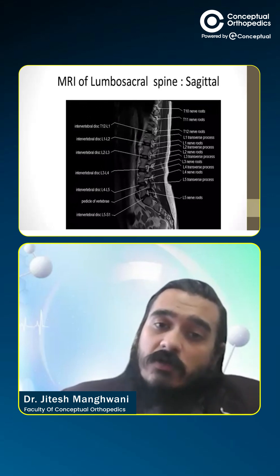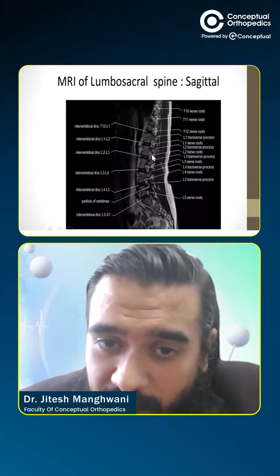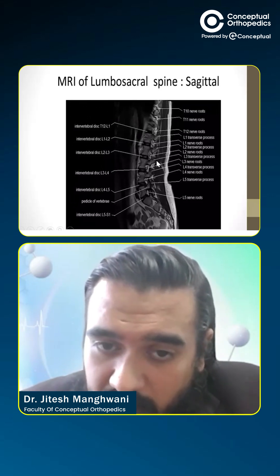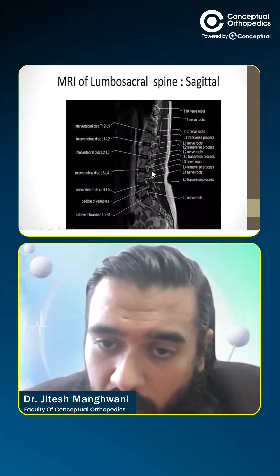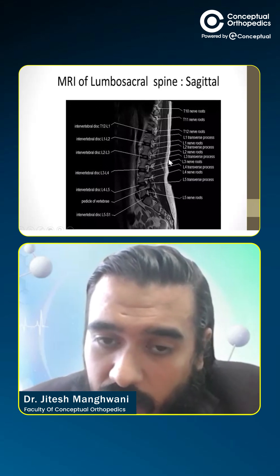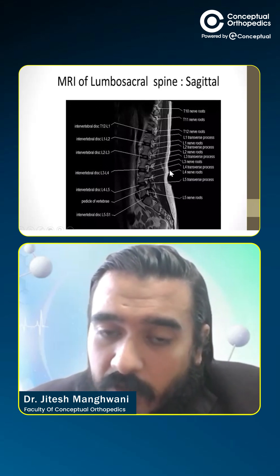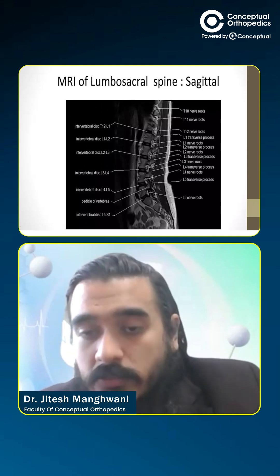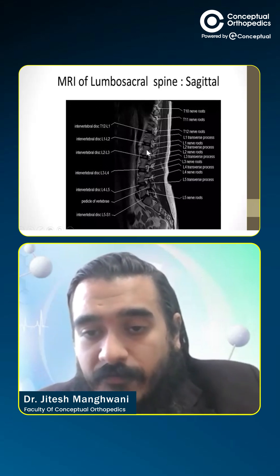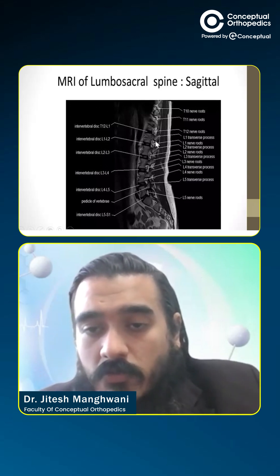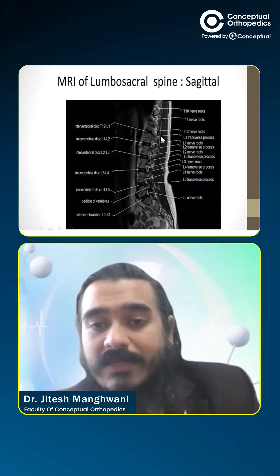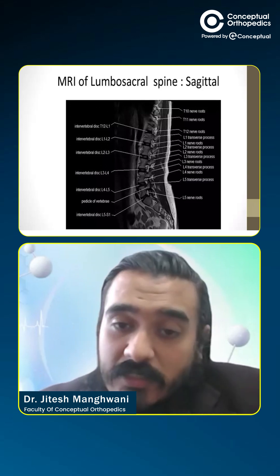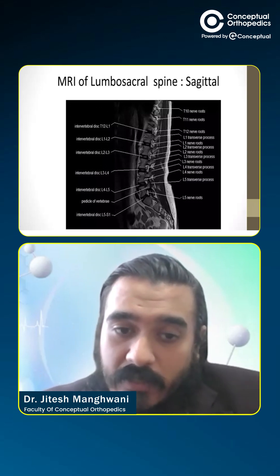The parasagittal image of the lumbar spine shows us the foramen and the nerve roots that come out of the foramen. The nerve root comes out from here and goes to supply the leg. All the different nerve roots — L5, 4, 3, 2, 1 — can be seen properly on this MRI so that if compression or canal stenosis is present, you can identify it.